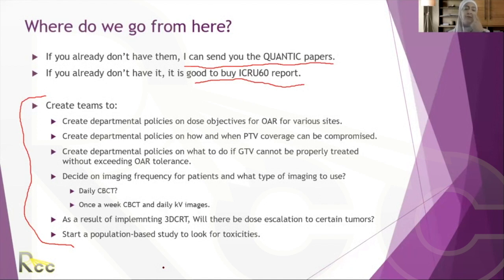As I said, you also need to have protocols for the setup of the patient and the size of the CT cut. For example, 2 millimeter for breast, you don't need that for a CT scan. But maybe 2 millimeter for head and neck is needed. So you do have to include radiation therapists and CT SIM technologists. So you have an entire departmental protocol that goes from what to do for this patient from CT SIM all the way to treatment.